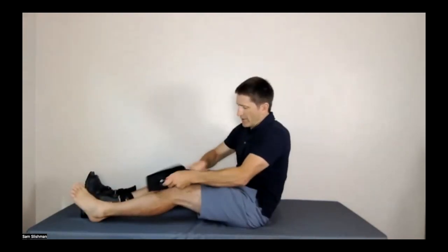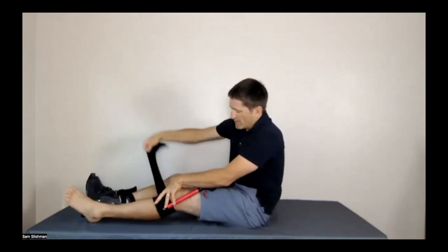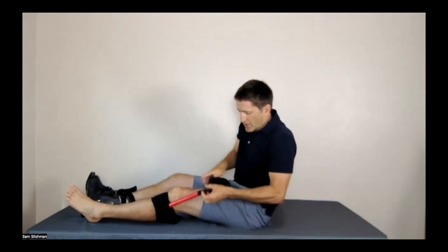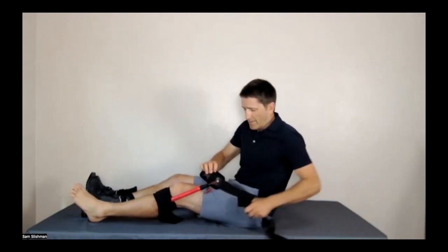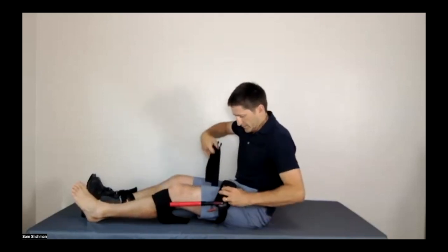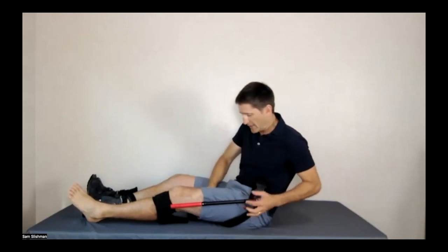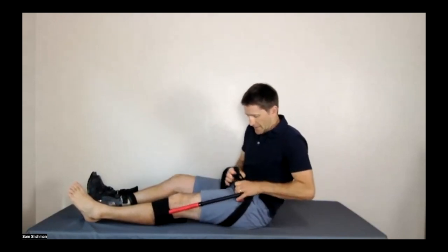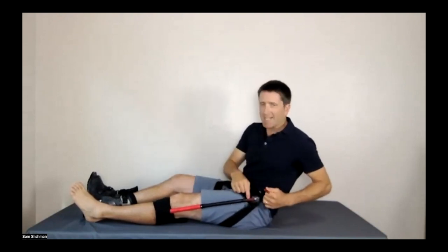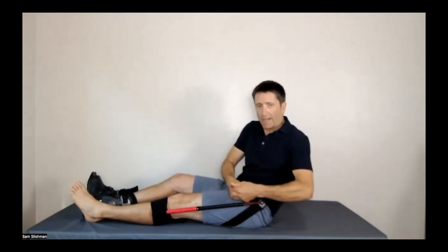I'll just put this on really quick here to make sure that you see what's happening. This goes proximal to the calf. Similar situation here. Buckle, female buckle anterior. And I'm going to pull this out until that spring button locks. Lock that in place. And then again, my traction is the exact same mechanism as previously. So I pull and lock.